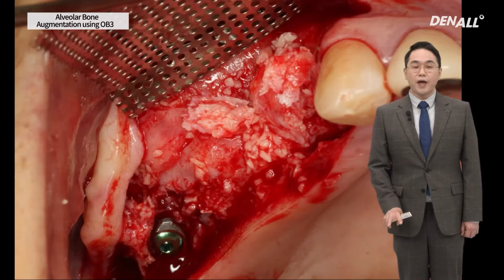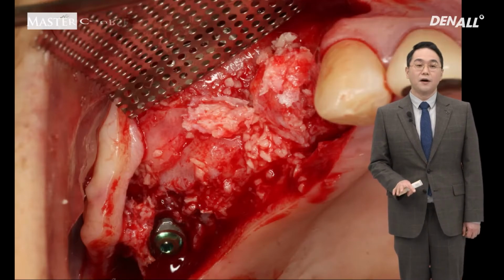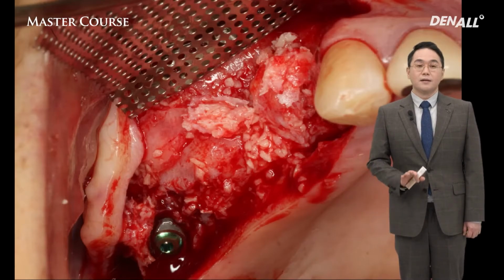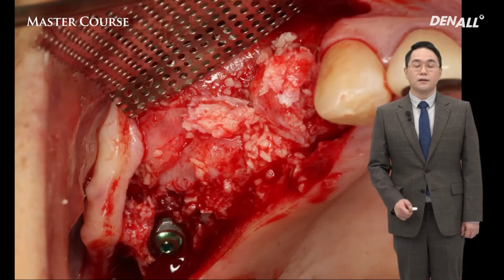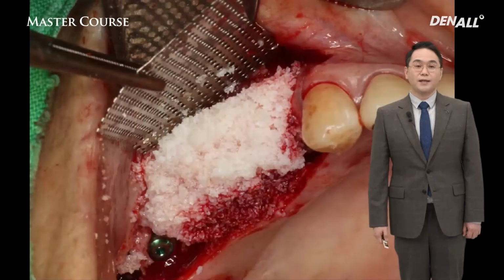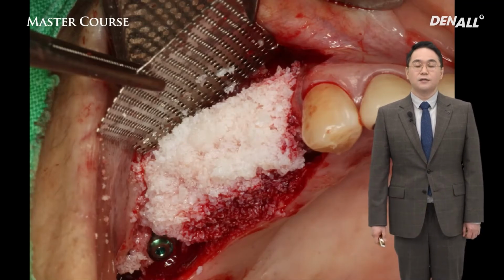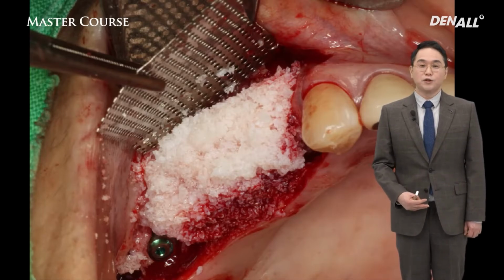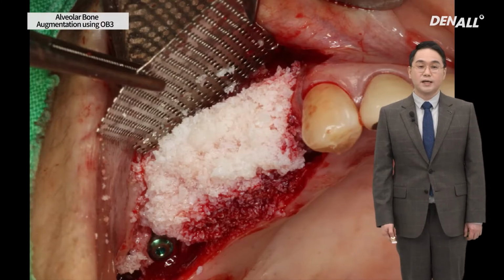2 screws are used to fix the buccal apical area. So first, stable adaptation is made apically. In the defect, the autogenous bone from tuberosity is put in, and outside, the xenograft material, sintered at low temperature, is used to make the contour. Bone graft materials are positioned to augment vertically and horizontally for ideal alveolar bone form.